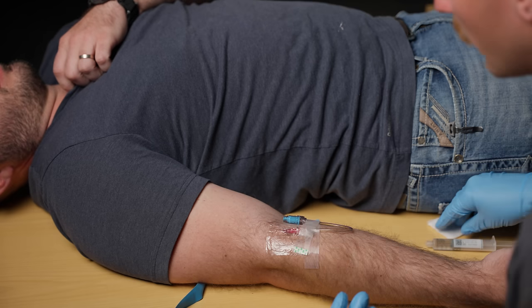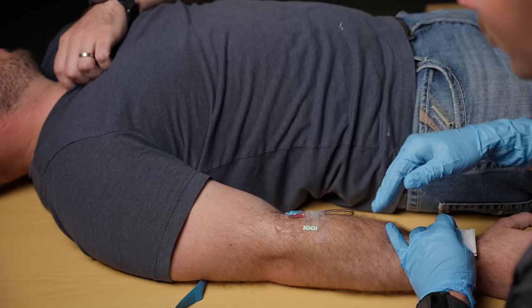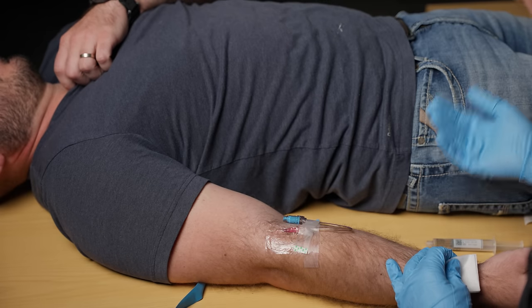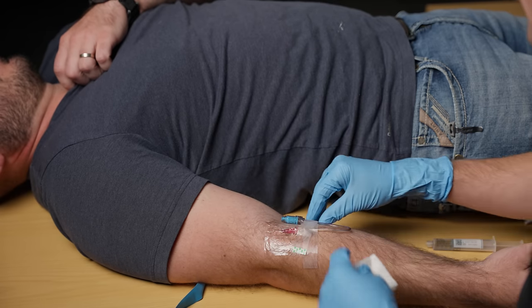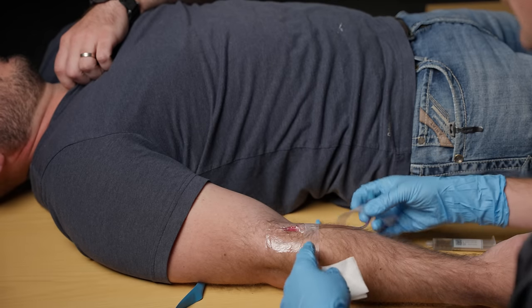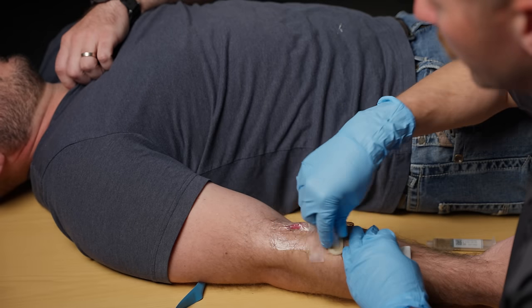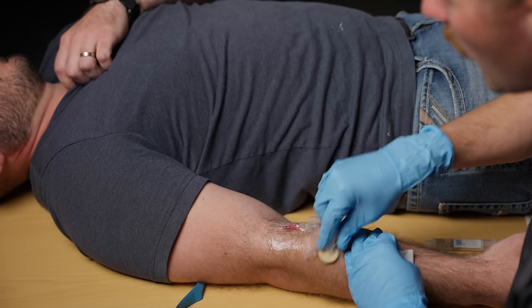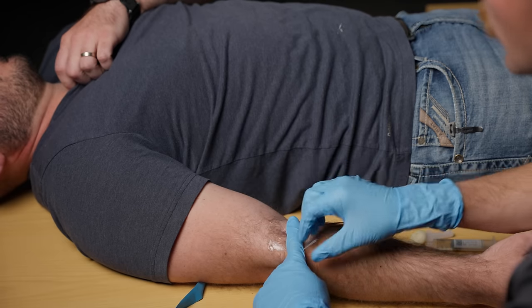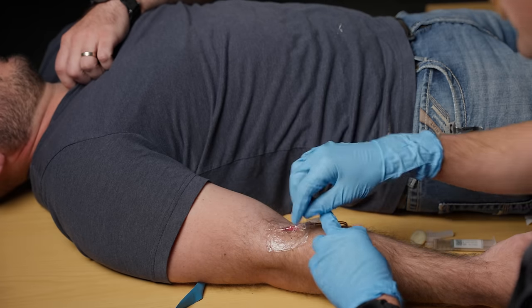For the removal of an IV it's relatively simple, and honestly a lot of patients — especially somebody like Brian here who's got a lot of hair on his arm — say this is a more painful experience than actually getting the needle to begin with. So right here I'm going to start undoing the tape. If you have some extra chlorhexidine you can rub it around some of the tape and it's going to help it come off with just that moisture and not stick as much, but really there's no way getting around the patient getting a little bit of a waxing on their arm.